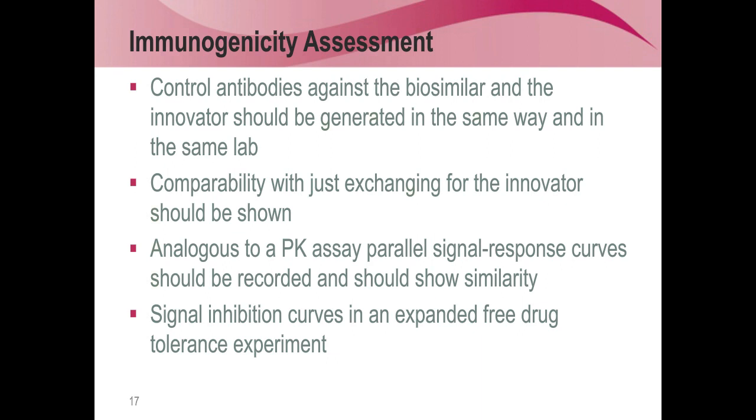So it is usually not okay to just work with commercially available or with monoclonal antibodies. That is still the gold standard, to use polyclonal antibodies, which are known to bind the biosimilar. And that's why it makes sense to generate those beforehand. And that takes several months.